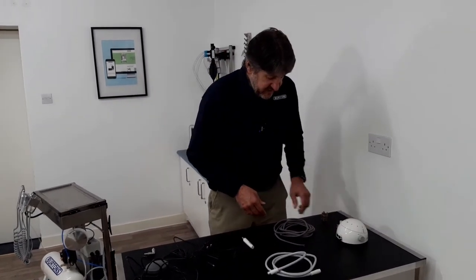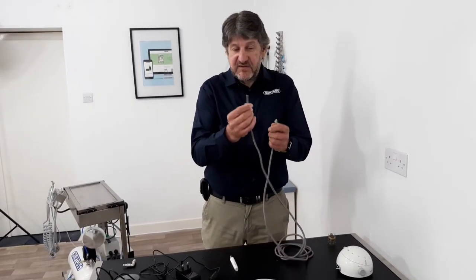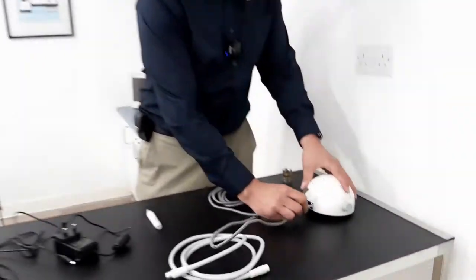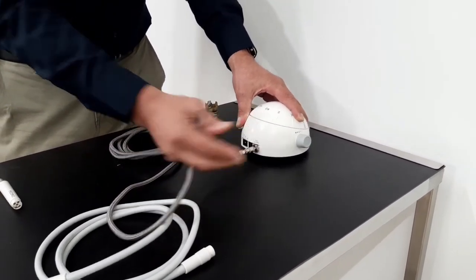First off, to connect the water hose, you'll see this has two ends. One has a metal connector on one end and it has a blank on the other end. The metal connector slides via a locking collar. To remove, slide the collar back; push to connect.